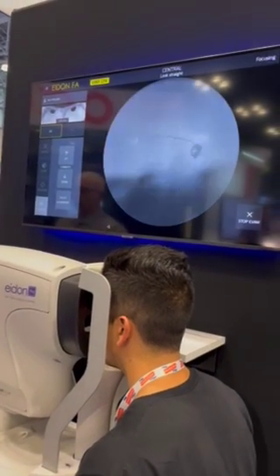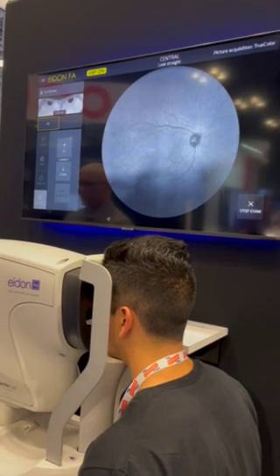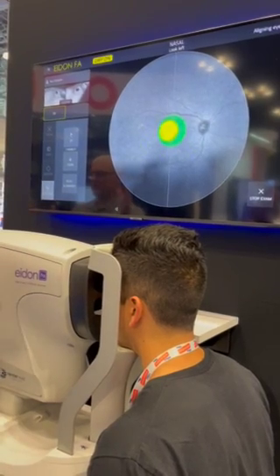So the arm is going to focus it, and when you hear the beat just keep your eyes wide open. That was the first central image. Now you're going to look to your left and find that green light — it's going to be outside of the system, somewhere over here.